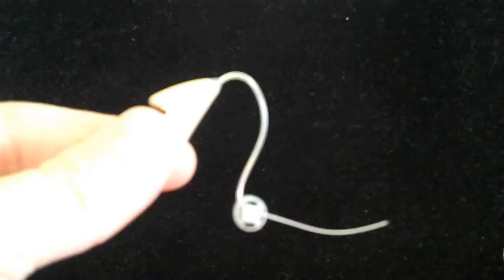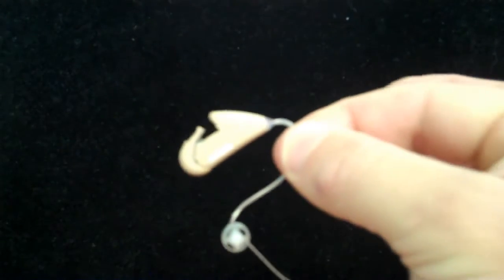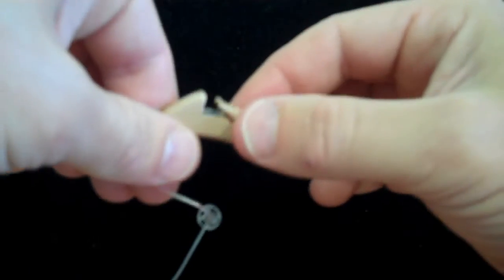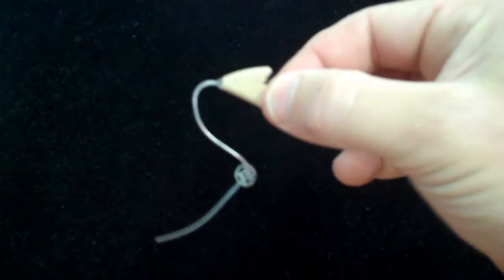While there are many shapes and sizes of wax traps, I'm going to show you the two most common that we use here at Victory Hearing and Balance Center here in Austin. The first of which, let's talk about a receiver in the ear micro style BTE. This is a very common style of hearing aid used today. This particular one is from a Swiss hearing aid company named Phonak.